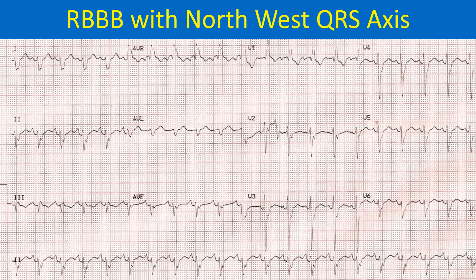The QRS axis is in the north-west region — right upper quadrant — which can mean either extreme right axis or extreme left axis deviation. RS pattern is seen both in the inferior leads and in the lateral leads.